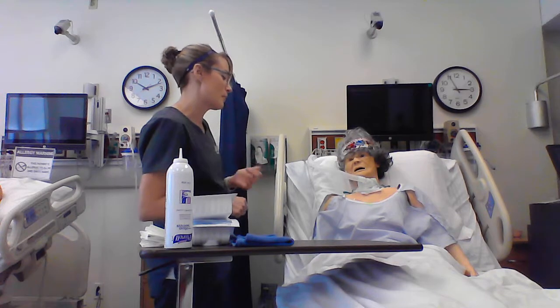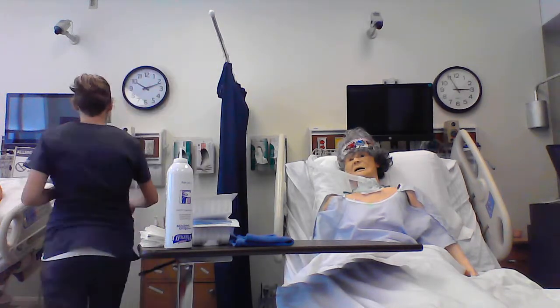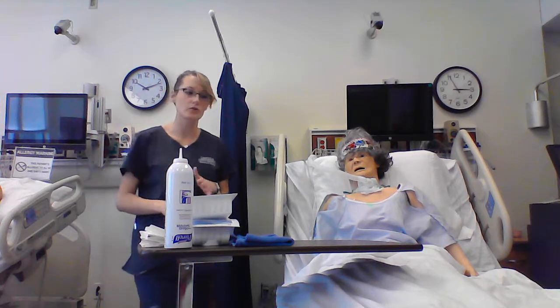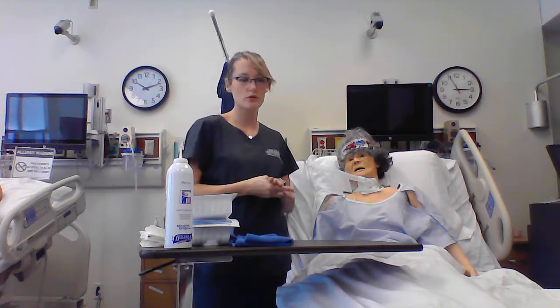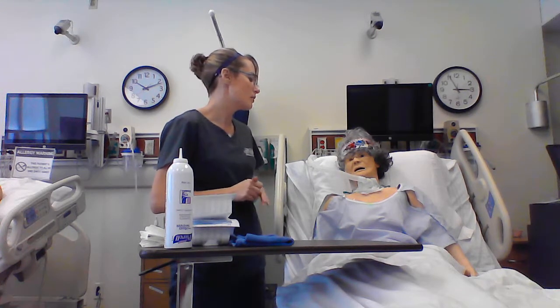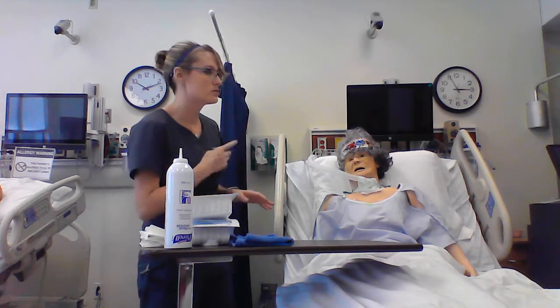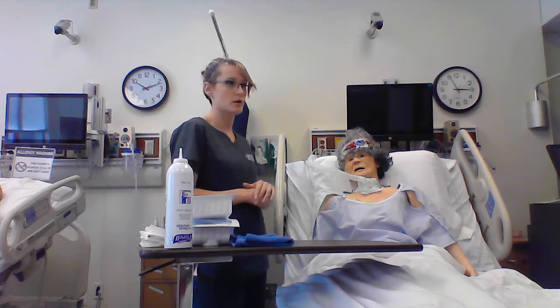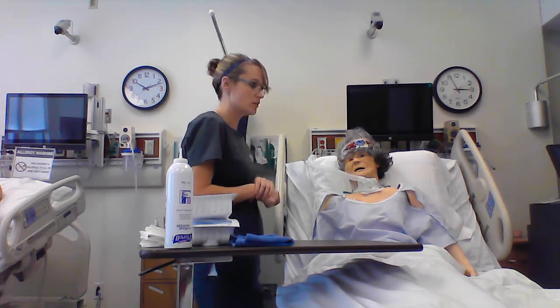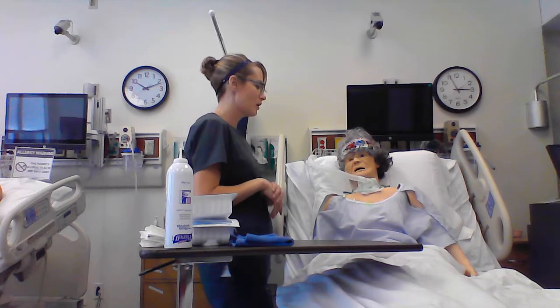I want to hyperoxygenate Miss Opal, since I am going to be taking her oxygen off, and turn my suction on between 80 and 120, staying on the lower end if her secretions are thin and minimal. If her secretions are difficult to get out or thick and copious, you can turn that suction up to aid in removal. Use your best judgment. You don't want to traumatize your patient's airway.